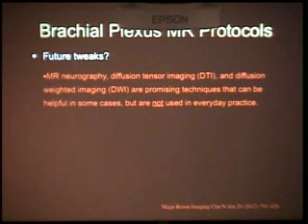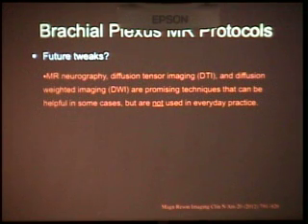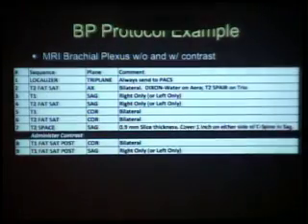In the future, as magnets continue to get more fine-tuned and we can have higher magnetic field strengths, there are already studies coming out with MR neurography following the nerve down distally. DTI, DWI, if you can add that to your protocol, that can be helpful. And there's still a lot of room for growth, because frankly, on a lot of magnets, these images still aren't the best, but they're getting better every day.